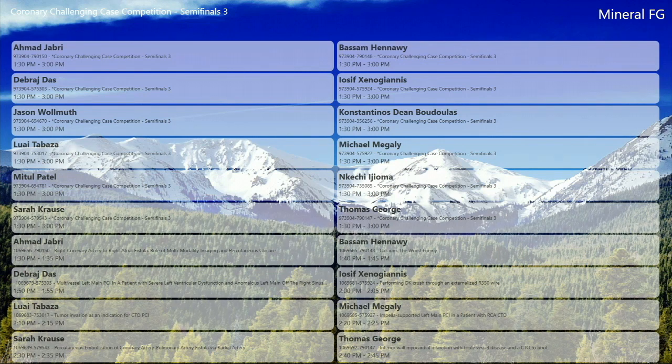I would say the one thing I would have probably done is make sure there was a second access for an IABP should you have needed it, because it's really hard to put in when you're doing CPR, which is certainly a possibility on a guy with a huge right prox occlusion, LAD CTO with collaterals from the right. So that would be, I guess, one feedback that I would have. I don't know if you guys have any other points or comments.